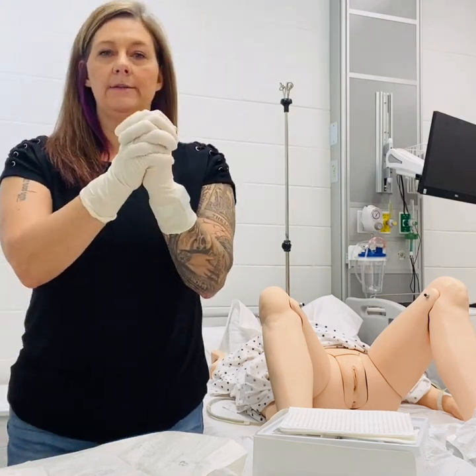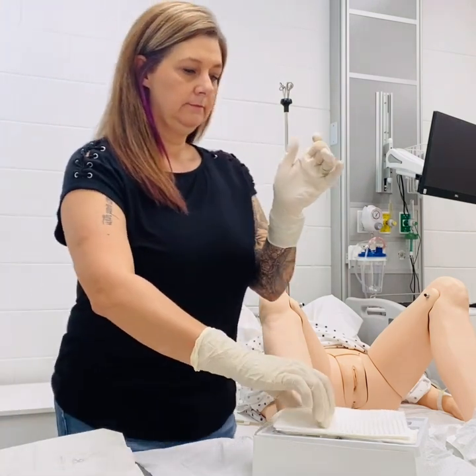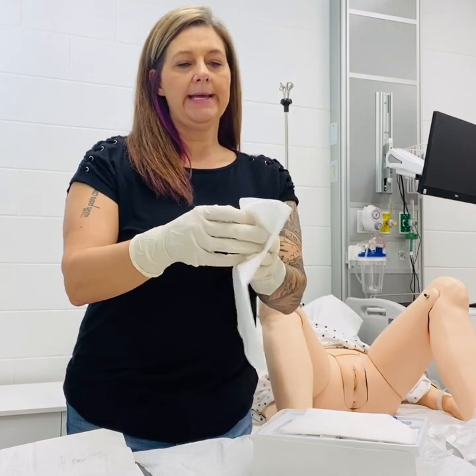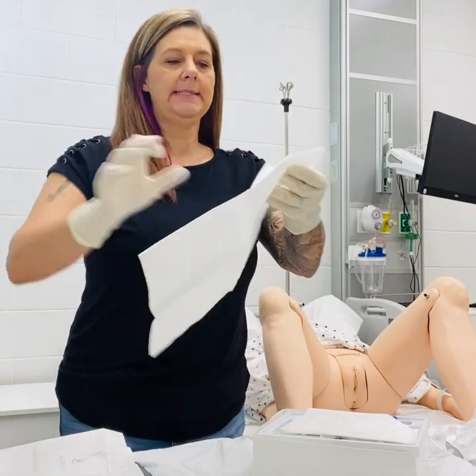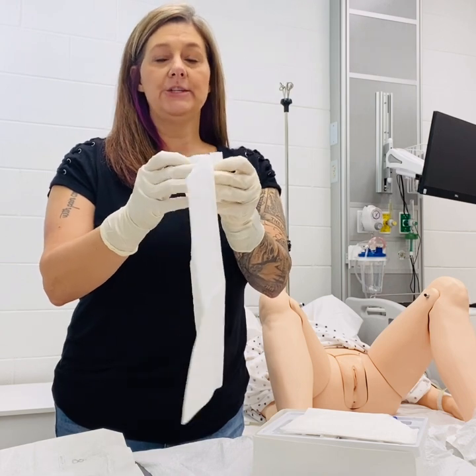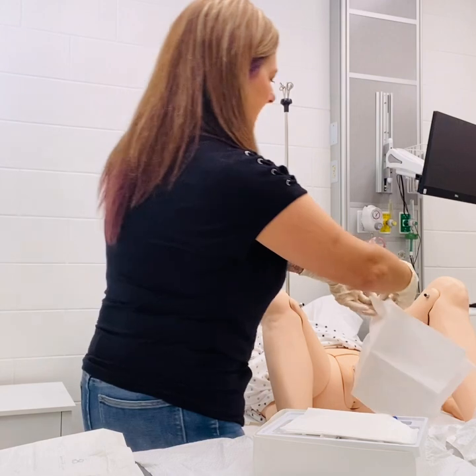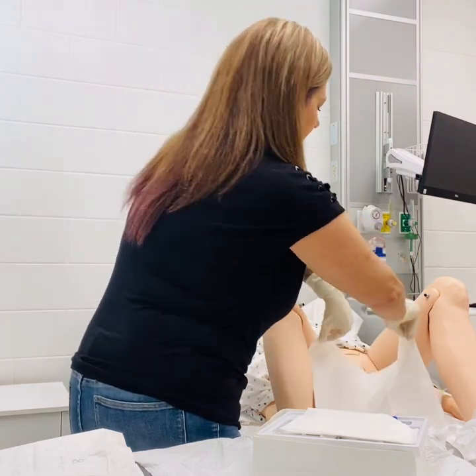Once your sterile gloves are on, you're ready to begin the procedure. Inside your package, you have a drape to place under the patient. You'll want to put the plastic side down and ensure not to contaminate your hands during this. You just want to reach right in between, open up, and lay down.